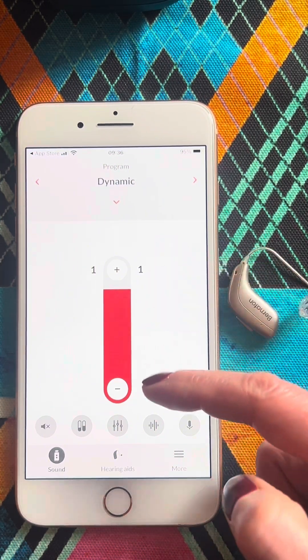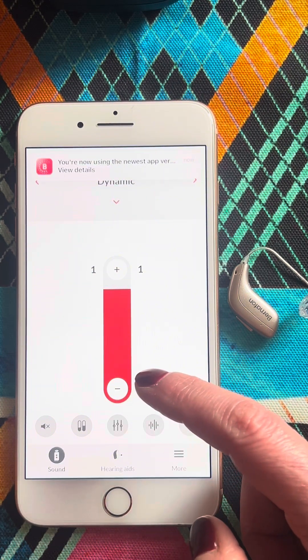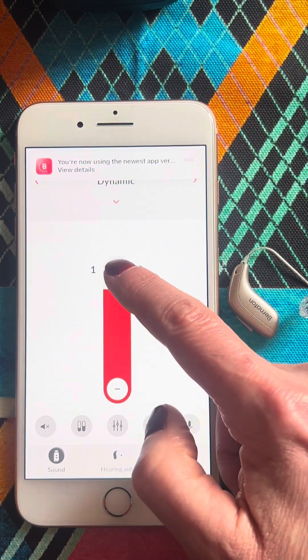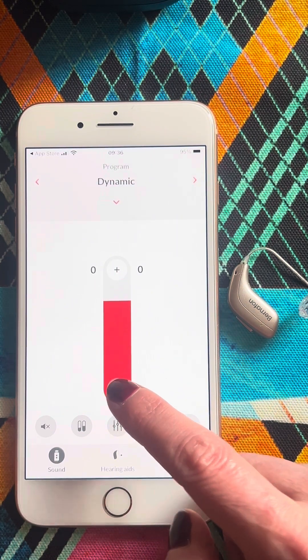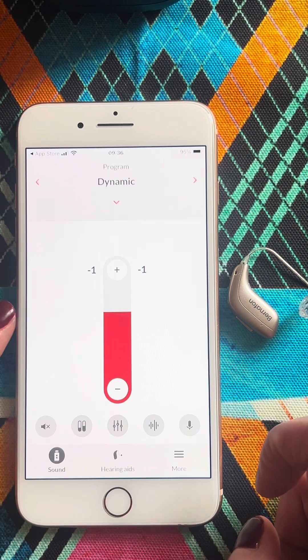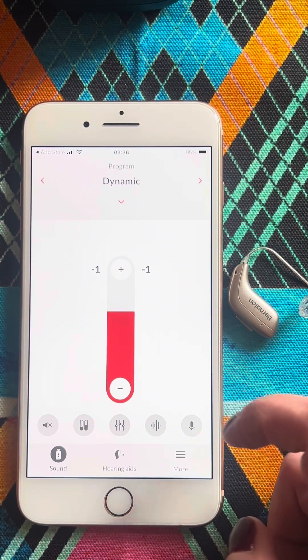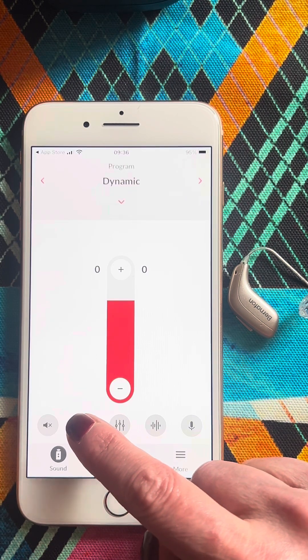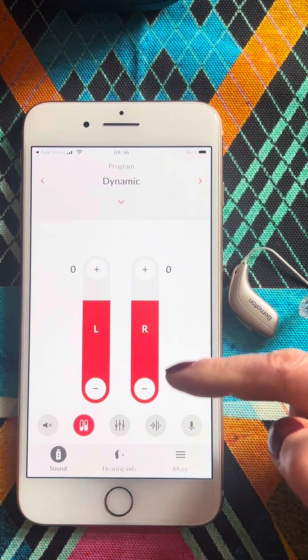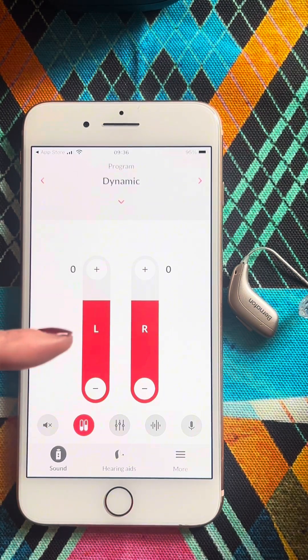The first here is a volume control. Just like a television remote, you can use the plus button to make things a bit louder, or you can use the minus button to make things a bit softer. Each morning when you pop the hearing instruments in, it will reset back to the zero line. If you wish to control the volume independently, you press this button, which will give you access to the right instrument and the left instrument.